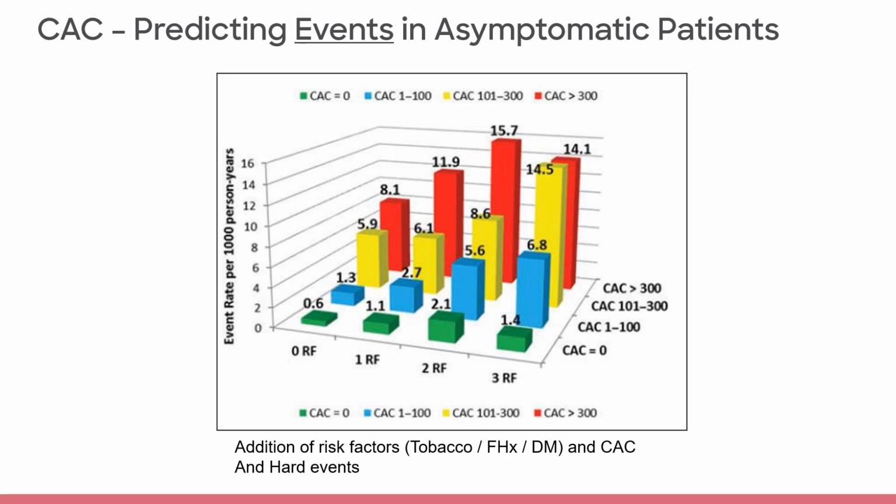You can't have a heart attack if you don't have coronary disease, and if you have more plaque, you tend to be in a higher risk group. It's not an absolute, but it follows a distribution that can then give some insight into what somebody's risk factors or what somebody's risk is based on what their calcium score is.